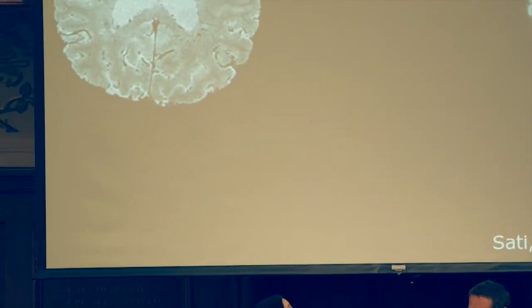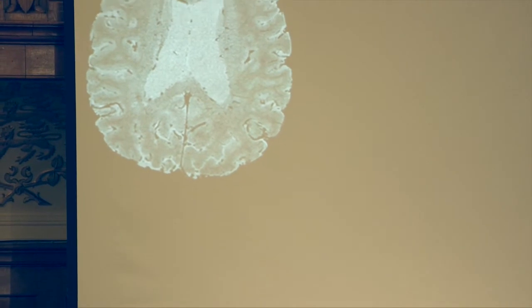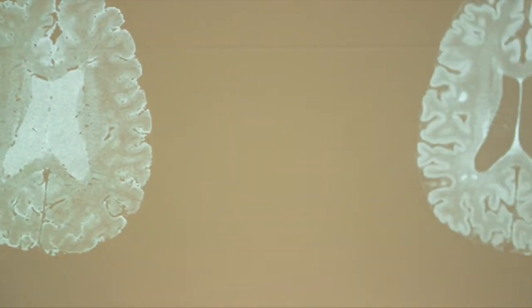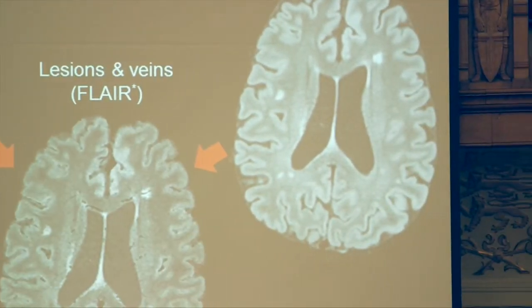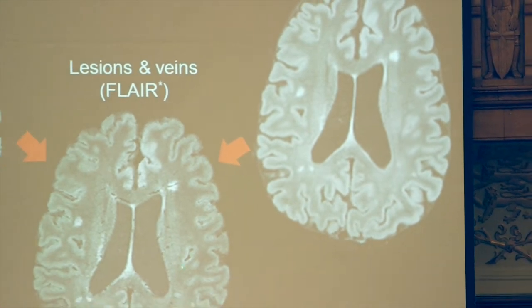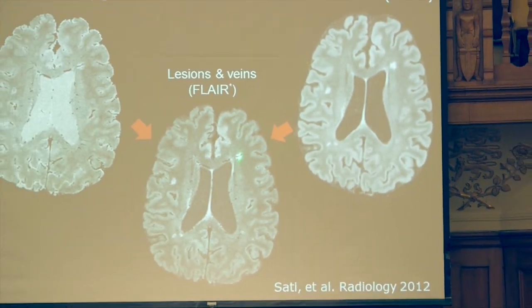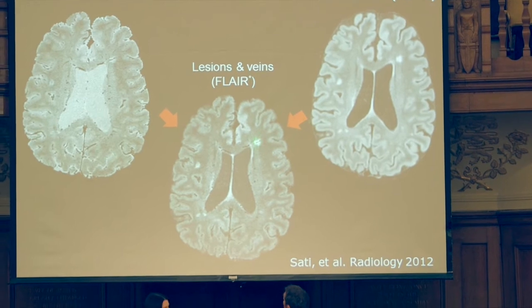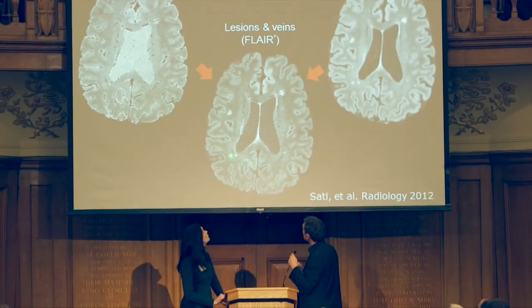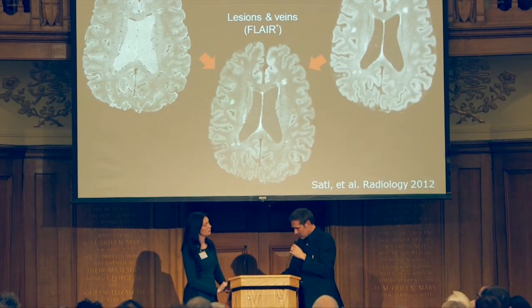When you combine that with the lesion scan that we've done for donkey years, on the right side here for you, you come up with what can be called FLAIR star. So you can see that there's a lesion clearly with a dark area in the middle, and that represents a vein, at least we believe so. And here there's a dot doing the same, and here as well.